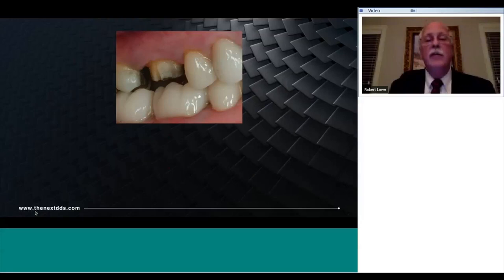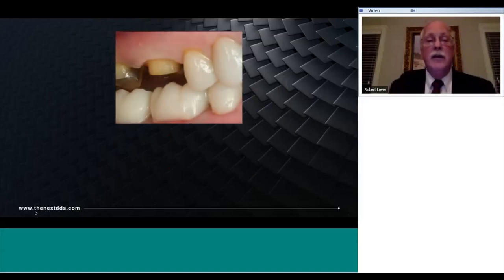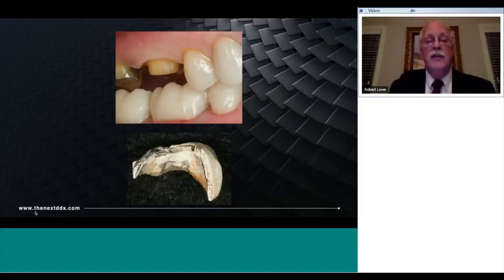Originally, cutting off that upper first molar, there is not enough occlusal clearance for metal and porcelain, period. This is one of the most frequent causes of restorative failure that I see as a dentist, and we blame it on the material. It's not the material, it's the lack of preparation. Make sure there is a millimeter to a millimeter and a half of space.